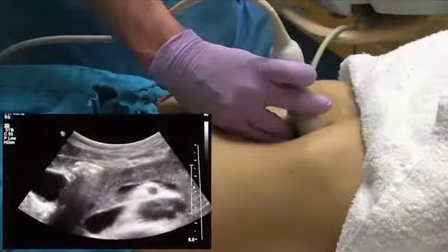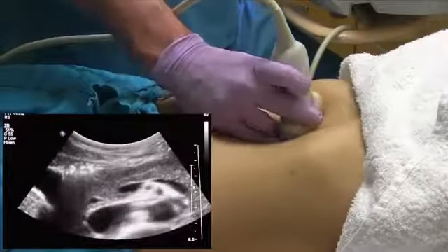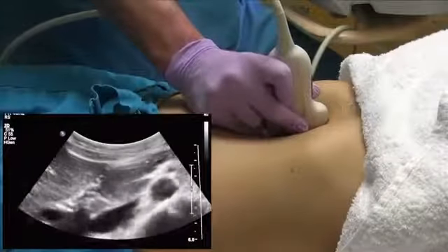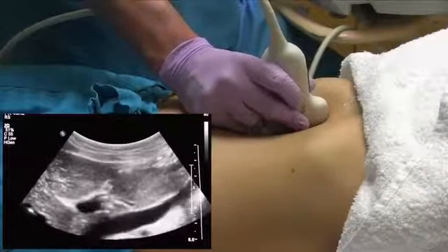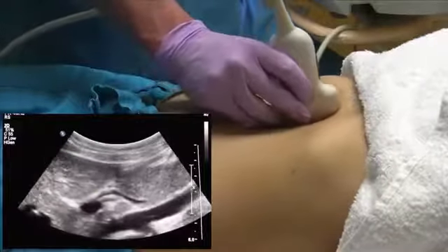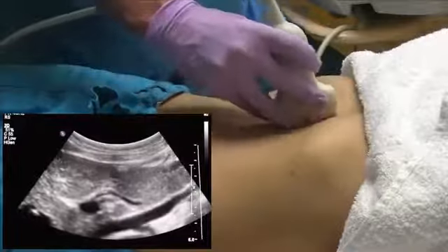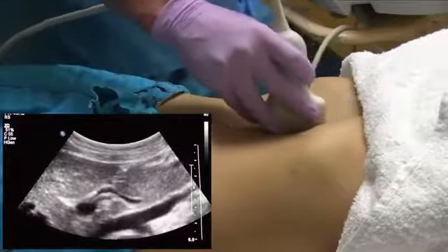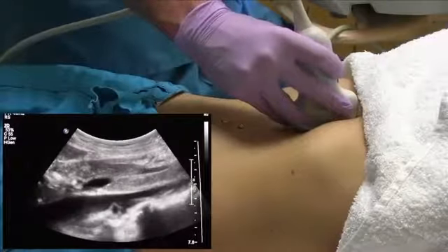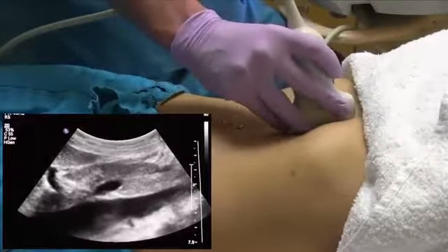All right, and if you find the CBD, you can also turn sagittal to the CBD from this position and elongate it as it goes into the liver. If you do see anything in the pancreas also, you could get transverse images of the pancreas, which for that your probe will be in a sagittal plane to the patient's body.